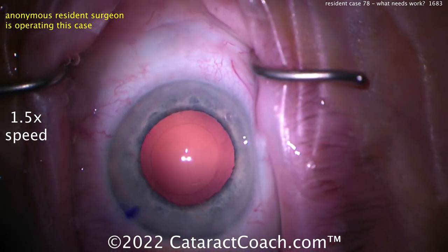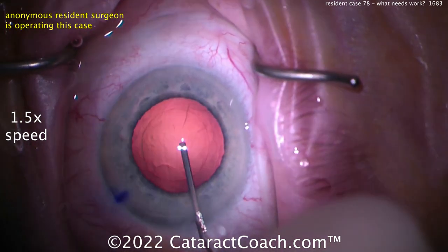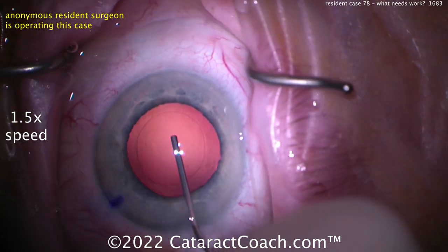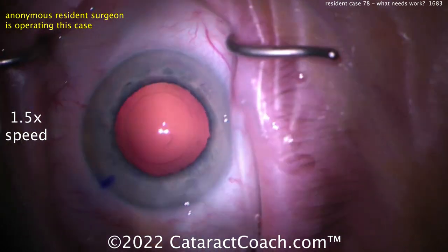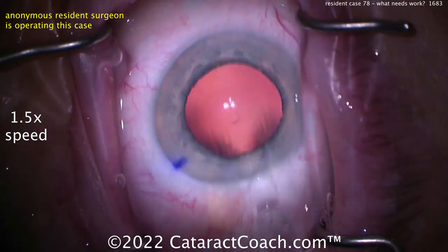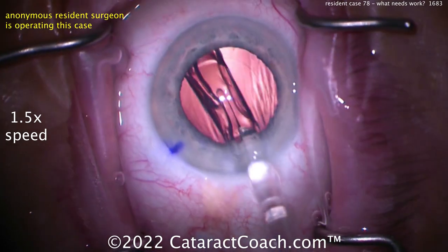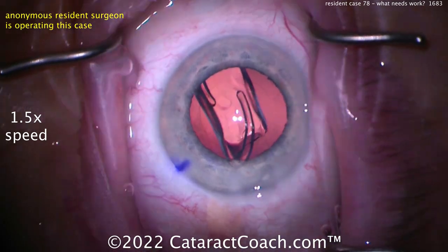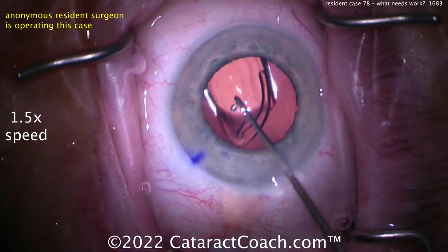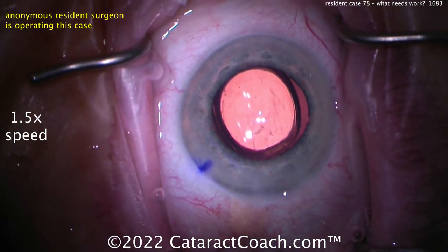Good job cleaning up the capsular bag — a little wispy strand there, you can get that out. Pretty good — even a little polishing on the undersurface of the capsular rim. Beautiful. Now the viscoelastic going in the eye — there's the cohesive viscoelastic getting a good fill of the capsular bag. Let's see the lens coming up — someone loaded the lens, or it's pre-loaded. Delivering the lens, getting it in the capsular bag — looks good.